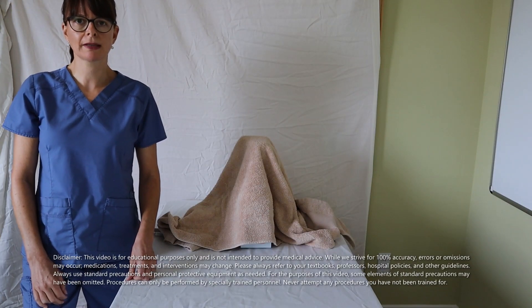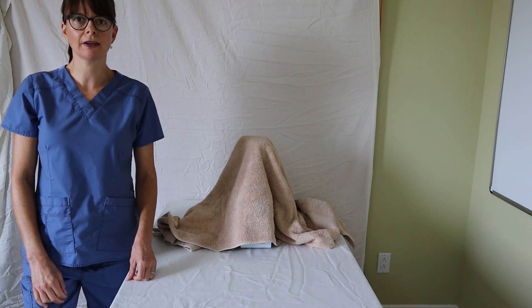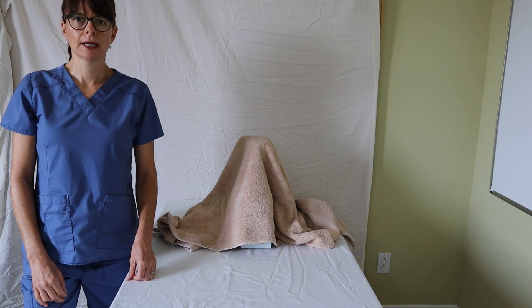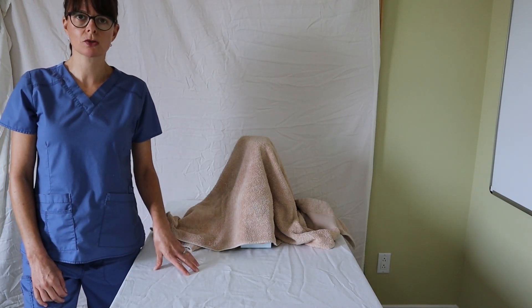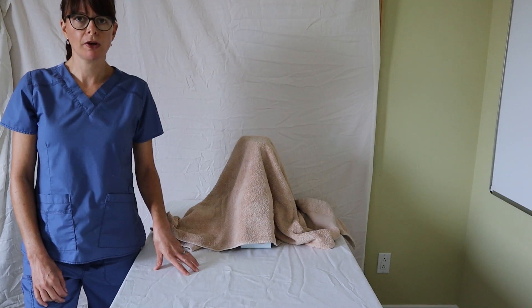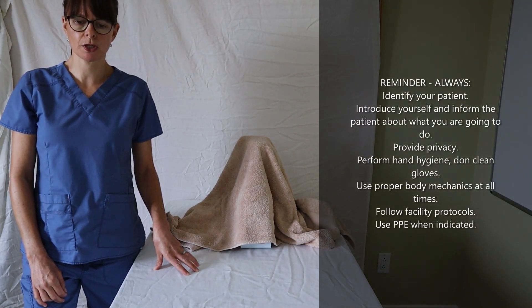Welcome to Nursing School Explained and today's video on how to place a Foley catheter in a female patient. Keep in mind that I only have a model here that we'll be using today, so always make sure that you follow the appropriate steps of identifying your patient and explaining the procedure.